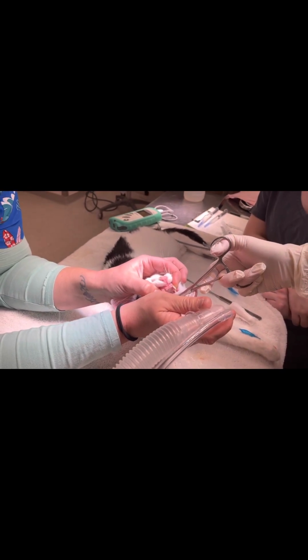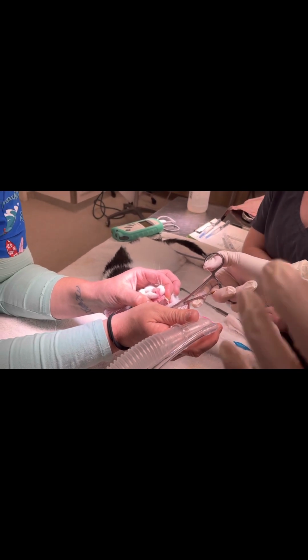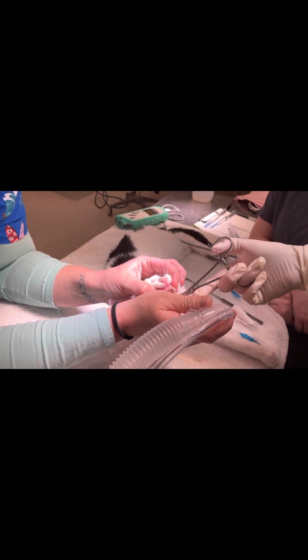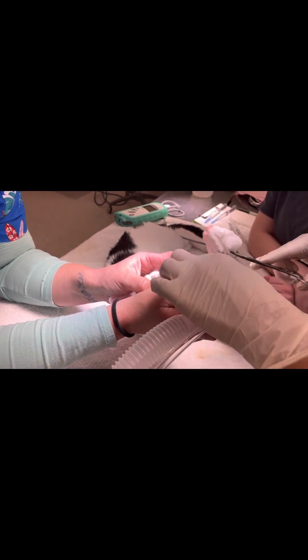They can recur. I've had a couple that have recurred. I've had one who had a really big ear. We did that one yesterday. And you know, they're really easy to avulse. You just got to be brave enough to do it.